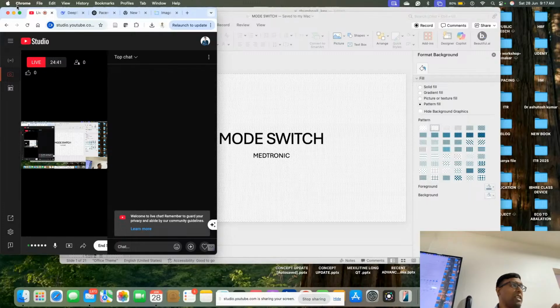So there is a switch between DDD and DDI mode, and this switching happens when the device captures a particular type of atrial event, say 4 or 5 beats which are out of the order. It will say there is something happening in the atrium. It may be atrial fibrillation, and atrial fibrillation should not be tracked to the ventricle, because the atrial fibrillation rate is how much? 300 to 350. So it would convert it to ventricular fibrillation. Even though the device has a higher tracking rate, that is different, but the patient will be more symptomatic. So we don't want a heart rate of 170, 180, 190 in the patient, because he will suddenly have palpitations. This is the reason.